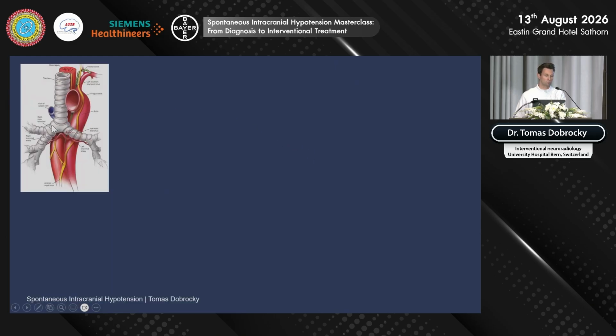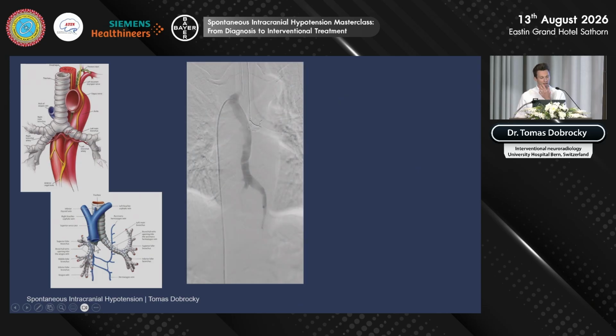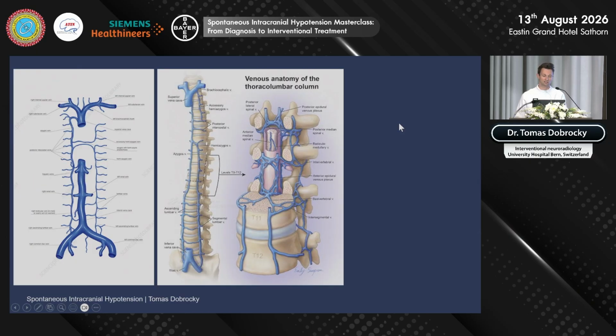And the important landmark is the right main bronchus. The azygous vein wraps around the right main bronchus, and this is the structure that we are looking for, because this is how we can identify the level where to take the turn for the azygous vein. As in this case, you can see the left main bronchus and right main bronchus. The patient is intubated, but it's quite easy and obvious to recognize the right main bronchus, and then you can easily get into the azygous vein.